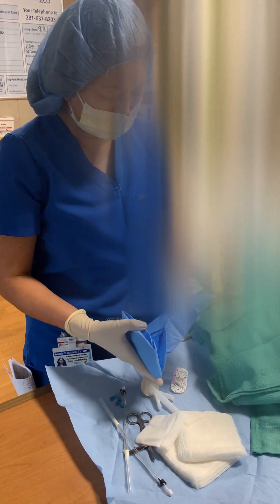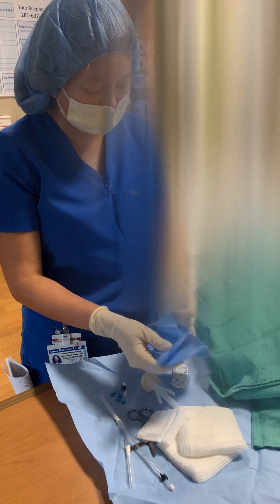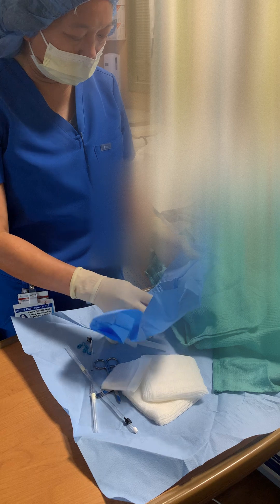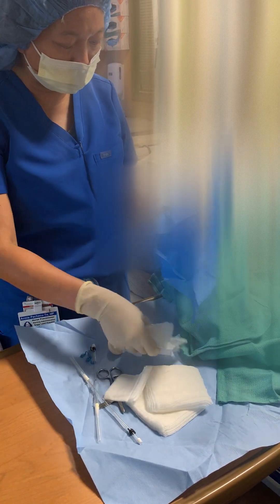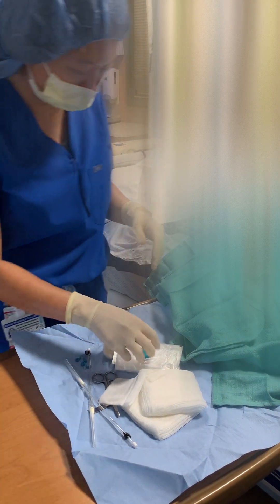Today we're going to place an arterial line. We place an arterial line on patients who are on vasopressors or vasoactive drugs. Arterial lines give you accurate measurements of your blood pressure versus your non-invasive blood pressure measurement.